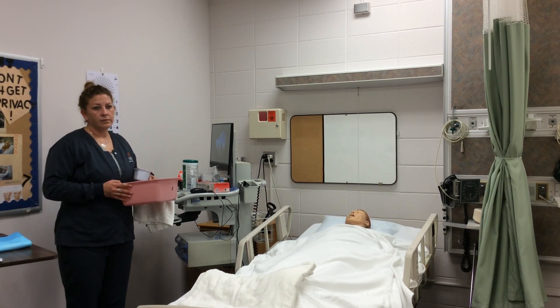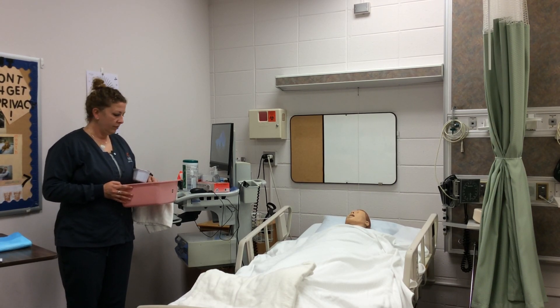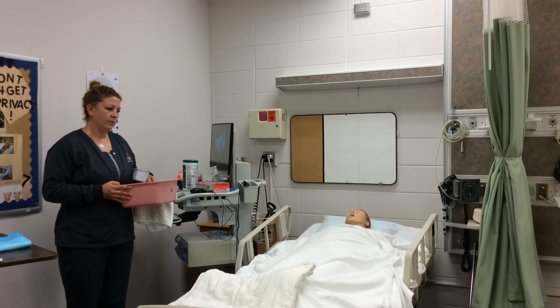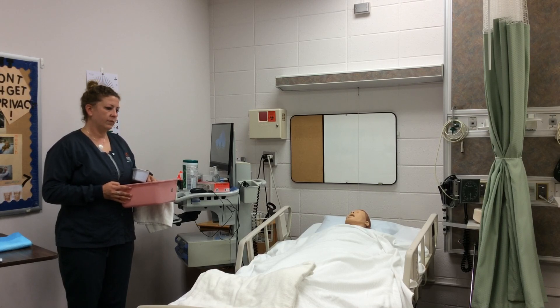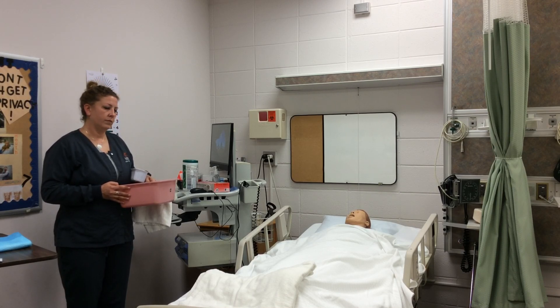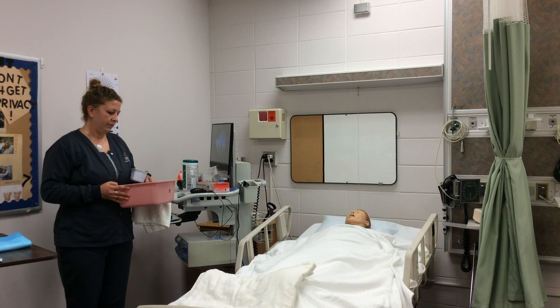Today we are taping NUR365, Revised Straight Catheter of the Male, Formal Competency.